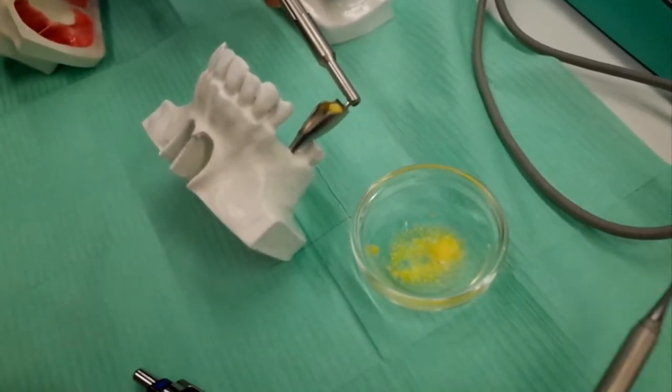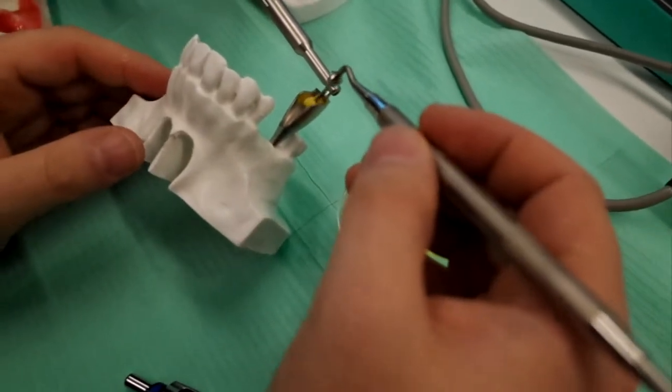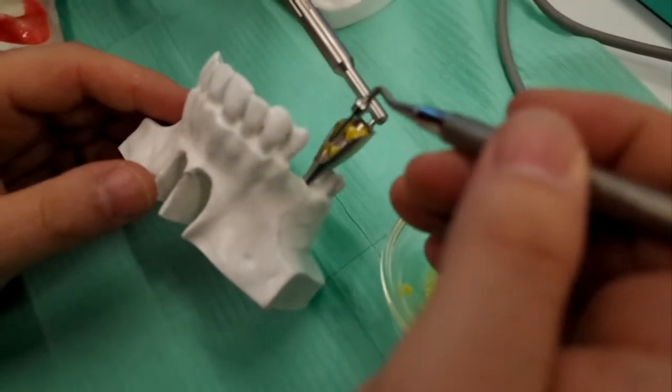I'm going to go up to this stitch. Now I'm going to stop it. I'm going to deposit it in small portions of the carrier.